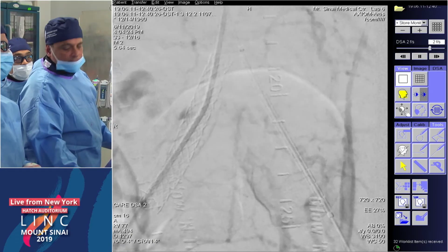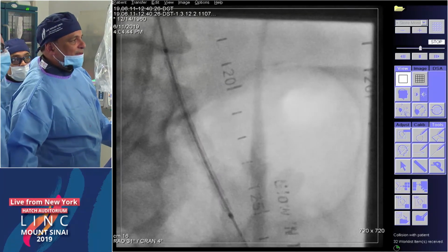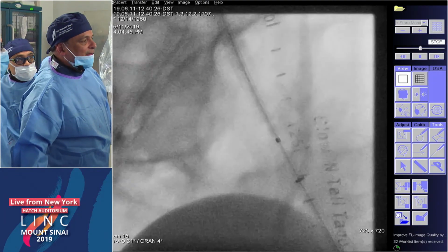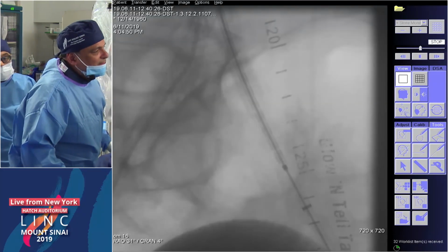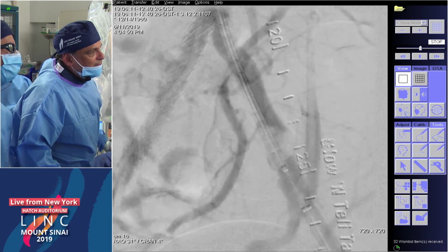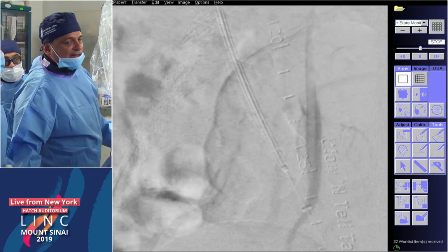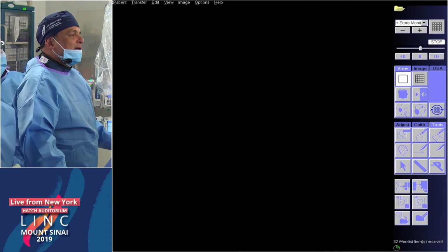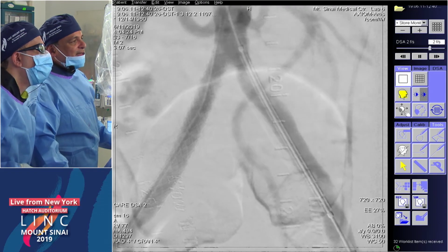I think the aspirin's sufficient. Yeah, so we're a little concerned about the hypogastric here. I don't know whether you guys saw that. So we're going to take a good look here. Approximately, I think we're good. Generally the ureter will cross right over the hypogastric, and that's a good marker. I think you're fine. Yep, I agree. I just want to make sure that we're all on board, because I think it's a nice case. Yep, we're good.